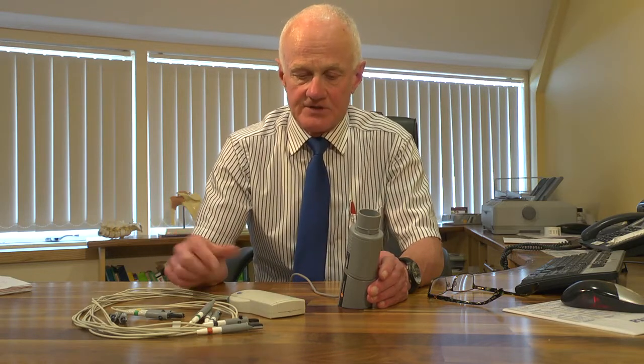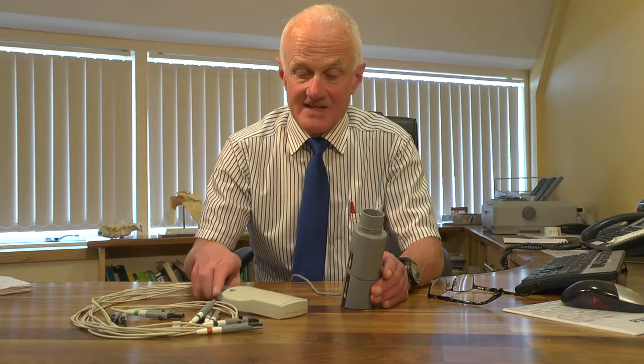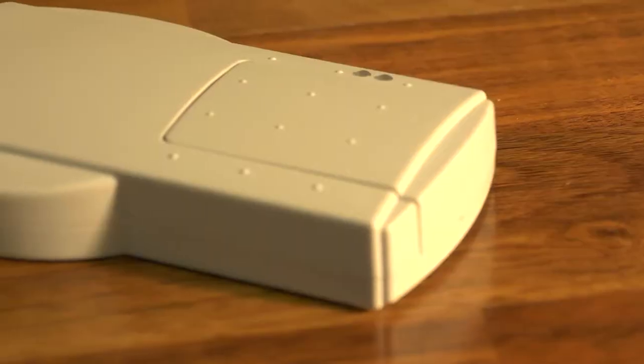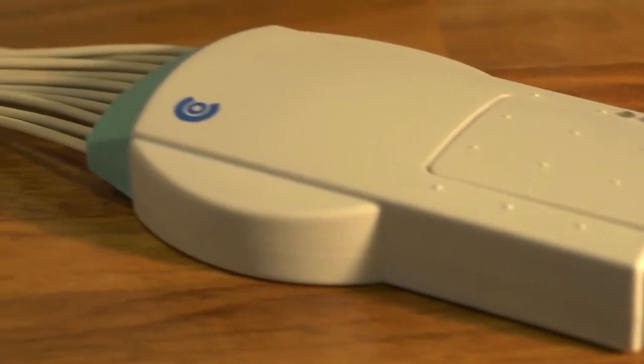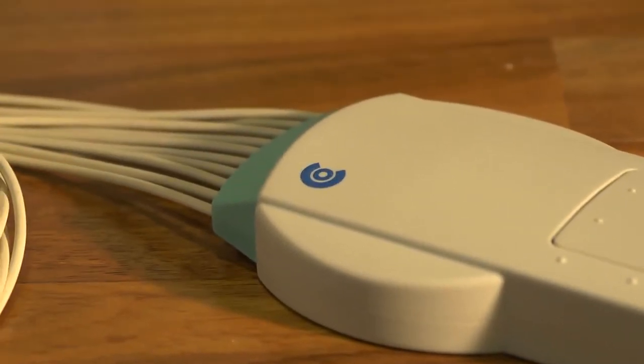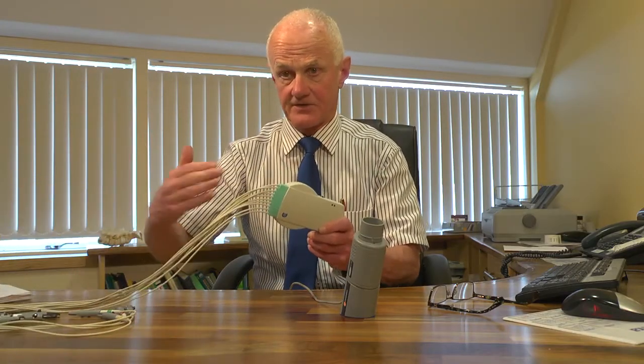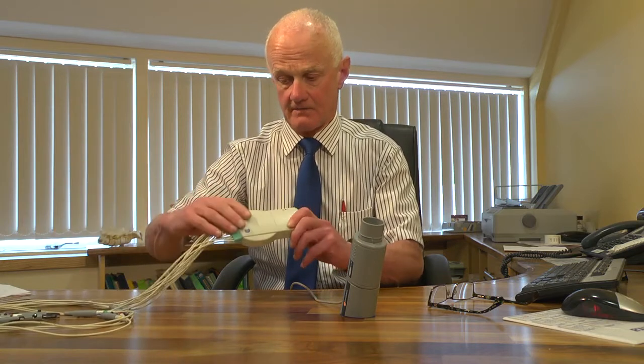Today I'm going to demonstrate two devices. One is an ECG device which we use every day, and this one is the custom-made Bluetooth ECG device. This is the entire device — there is nothing else. There's nothing to print out locally or hardware-wise, and you connect to the PC by Bluetooth to take the ECG.